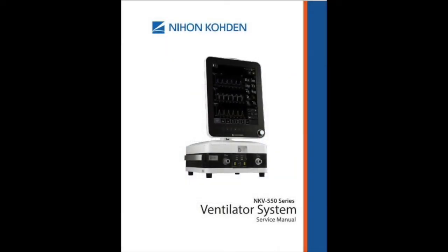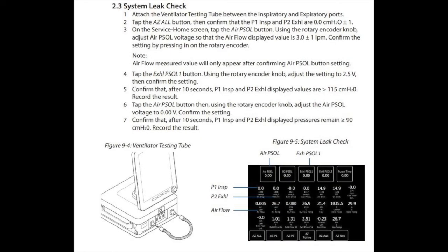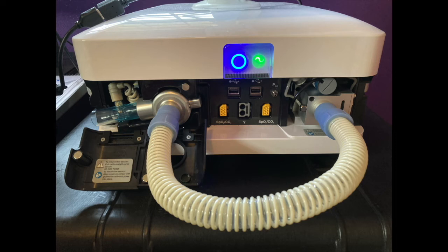To perform the leak check, I want to reference my service manual, and it's under the chapter for operation verification procedure. And there's a step-by-step guide. For the test, I want to at least be hooked up to air, and I'll need my 18-inch piece of tubing connected to both my inspiratory and expiratory side. Then next, I want to access my service menu.